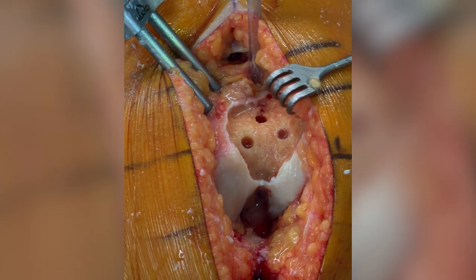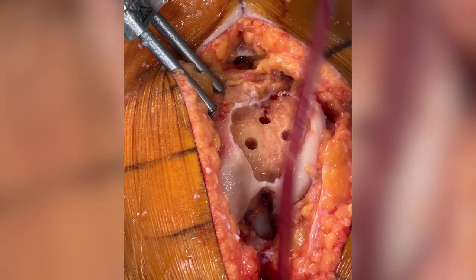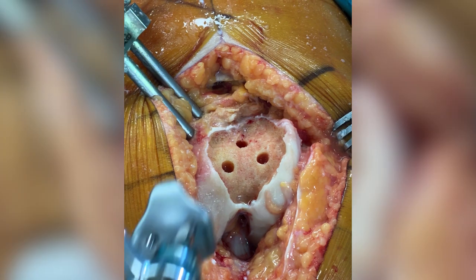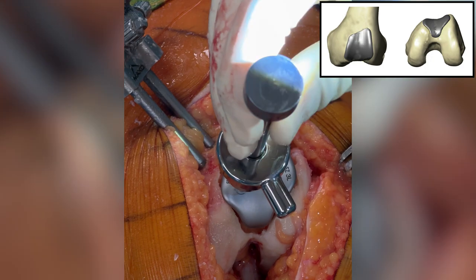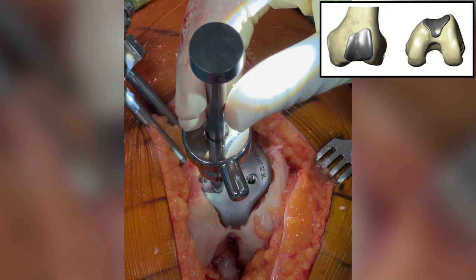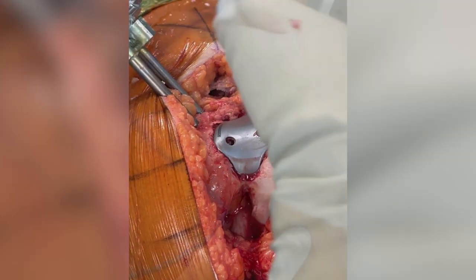The fixation holes have been drilled by the robot as well. Let's have the trial implant inserted. The trial implant is a little bit smaller than the final implant, so there will still be some margin between the implant and the cartilage with this trial, but that will have disappeared once we insert the final component. This looks excellent — we have a smooth transition.